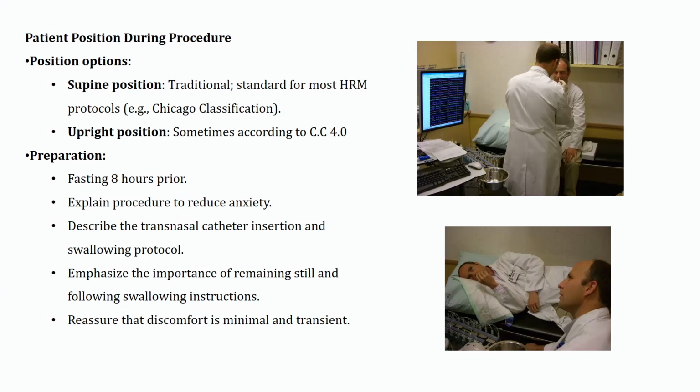At the end, it's not painful. It is a little bit annoying. It's not easy, to be honest with you. But at the end, it's not that painful. So the patient has to understand these points to be more cooperative with the nurse during the insertion. And it's very important also to let the patient follow the instructions during the procedure.